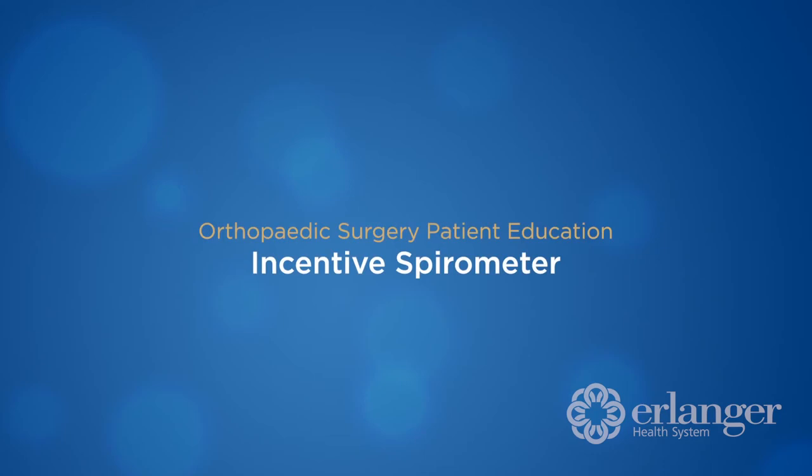After surgery, we are going to provide you with an incentive spirometer. This little workout tool will be used to help improve your lung function after waking up from anesthesia. It will reduce any low-grade temperature and decrease congestion after surgery.